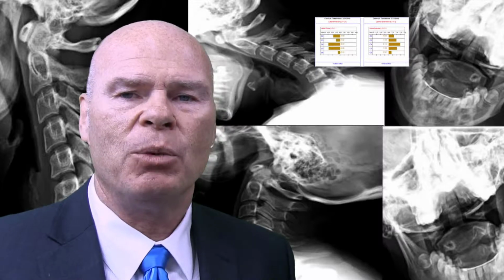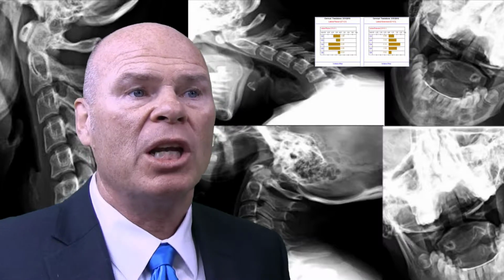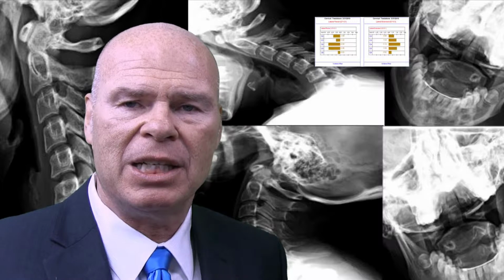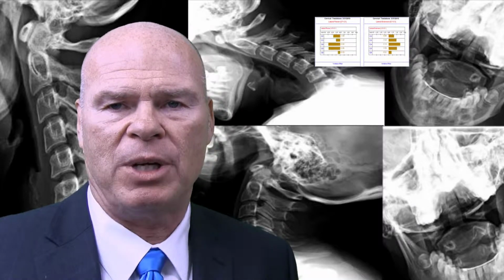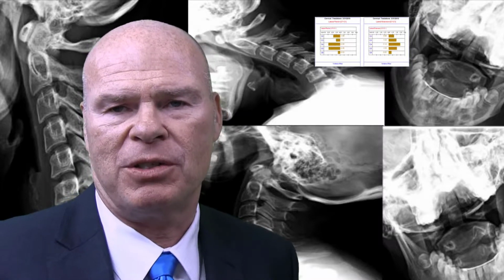First of all, they were designed for the profession of chiropractic in the assessment of certain things. So there were 5 things that a doctor of chiropractic was supposed to be doing with his or her x-rays. Number 1, a subluxation assessment.